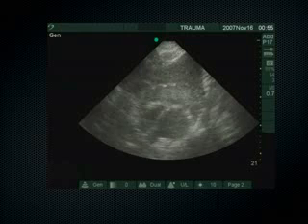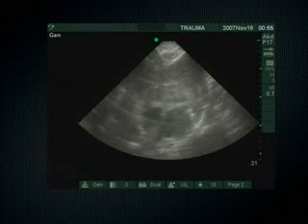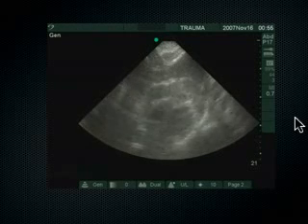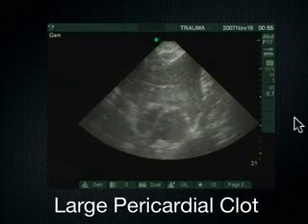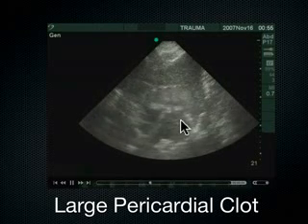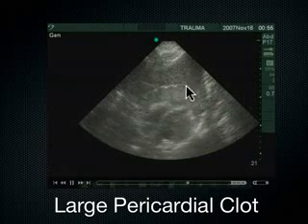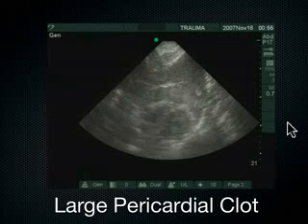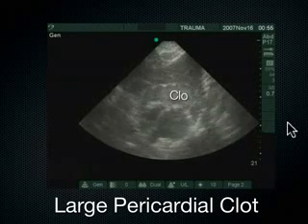What's the diagnosis? Yeah, I like that. Tamponade, why? Huge clot there. So if this is the liver, and this is the right ventricle, left ventricle. This is what view of the heart? Subxiphoid. The pericardium's out here. This is all isoechoic clot. If this happens, and we see this in our trauma bay, what do we need to do?